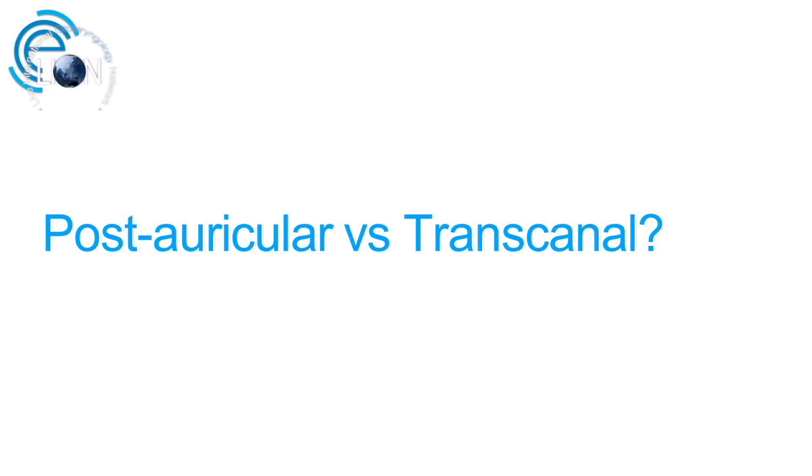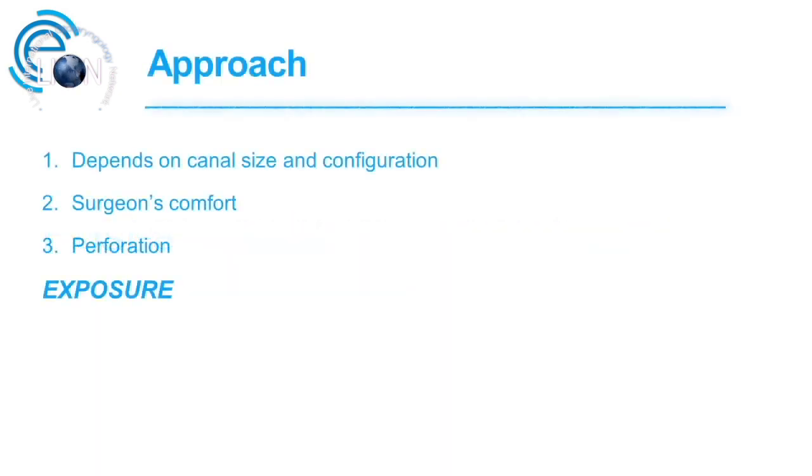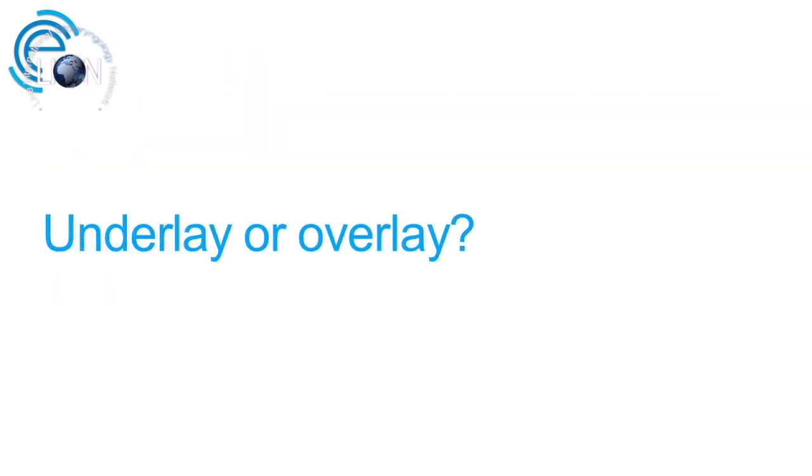Okay, approaches. We'll talk about the decision between a postauricular and transcanal approach, which depends on the canal size, and the configuration. Some canals are anterior, which limits your view, especially depending on where your perforation is. It really depends on your comfort. Personally, I have been doing the majority of these cases through a transcanal approach using the microscope. A small posterior perforation is much easier to approach through a transcanal approach as compared to a subtotal or anterior perforation, or somebody with a narrow canal. So it all really comes down to exposure. Whatever gives you the best exposure will eventually give you the best outcome, so go with that.